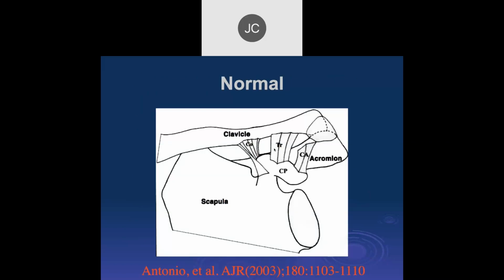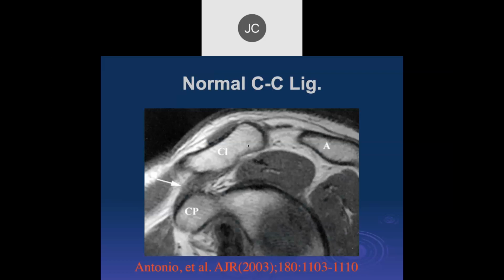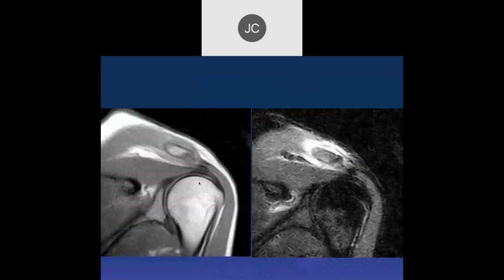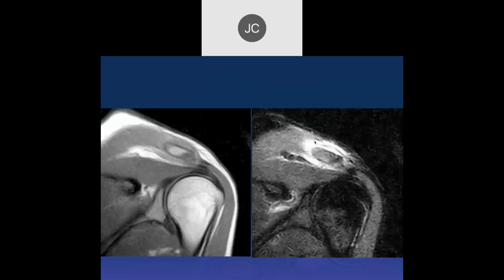So here we have normal. You have the coracoclavicular ligaments here, the coracoid, and the acromioclavicular joint with the capsular ligaments there. So here you can see the coracoclavicular ligaments well in primarily the coronal and sagittal plane. I like to always look at it in the sagittal plane where you can see it goes between the coracoid process and the clavicle here. And then here we can see the acromion over there. So we're medial to the acromioclavicular joint.